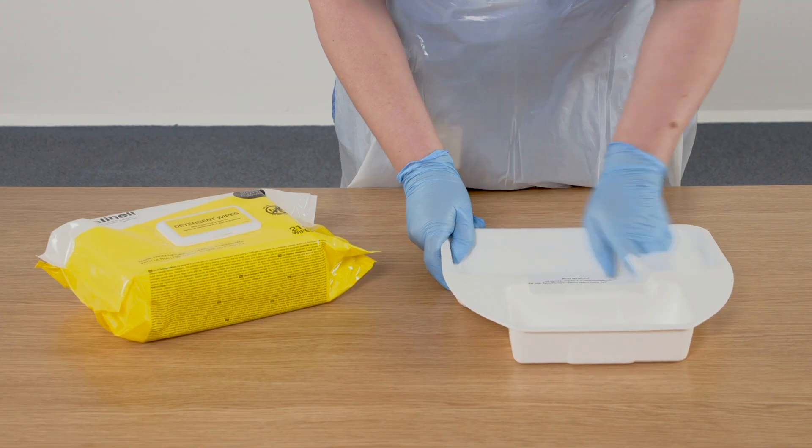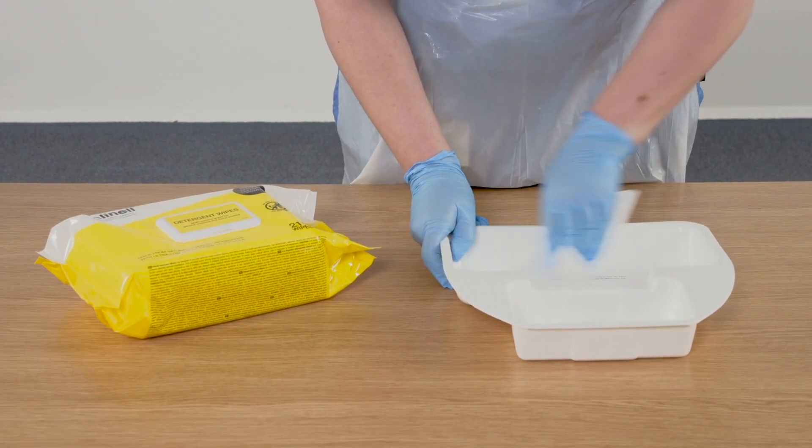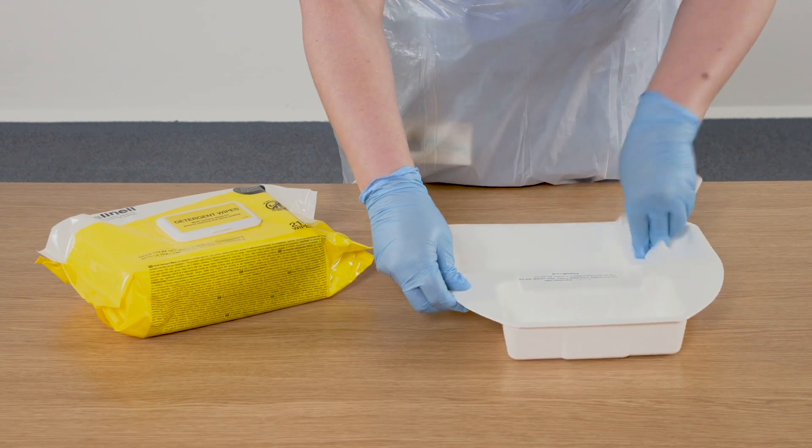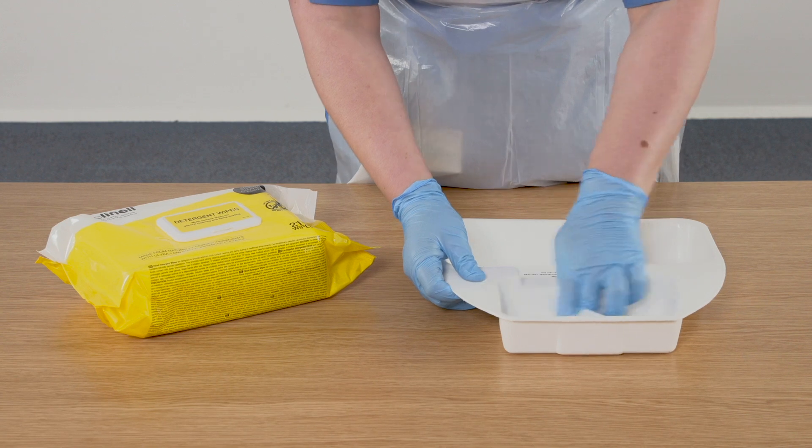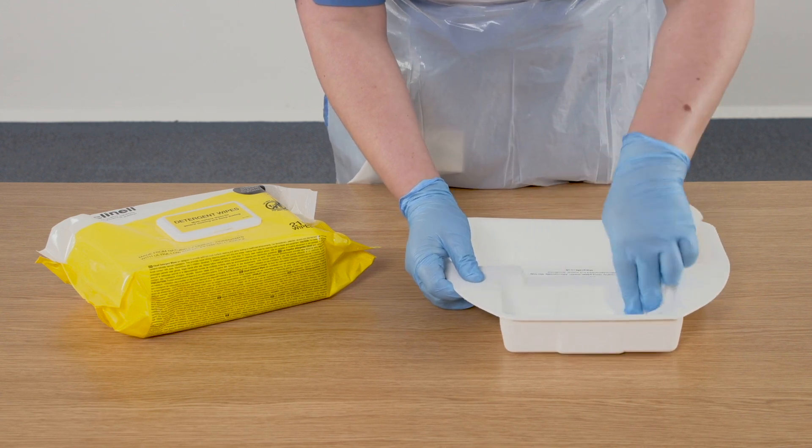I have performed hand hygiene and put on PPE. The first thing that I need to do is decontaminate the surface area that I will be using. I am using a detergent wipe to do this. Any surface that can be decontaminated appropriately can be utilised.